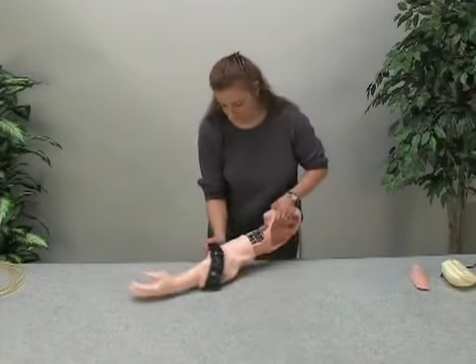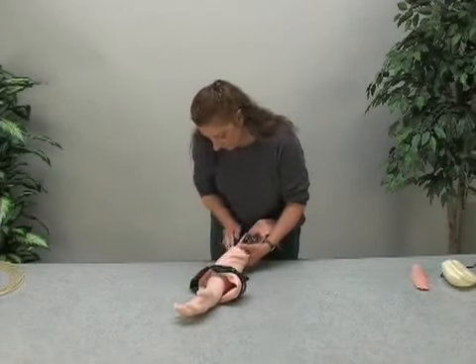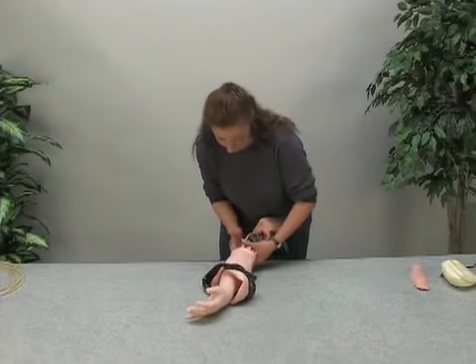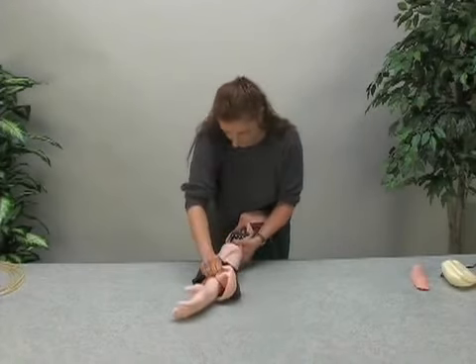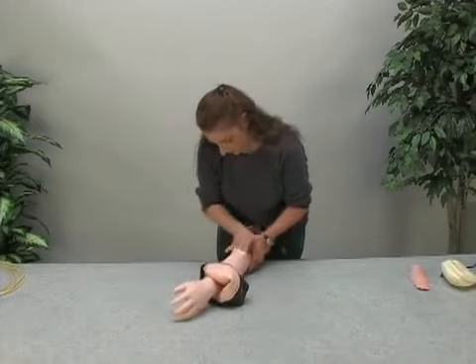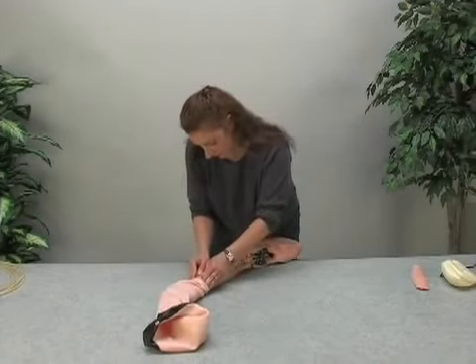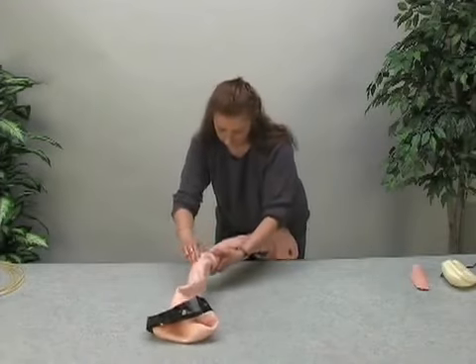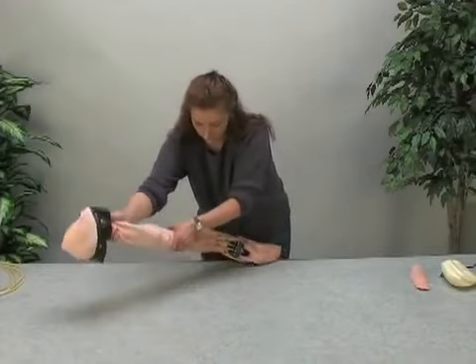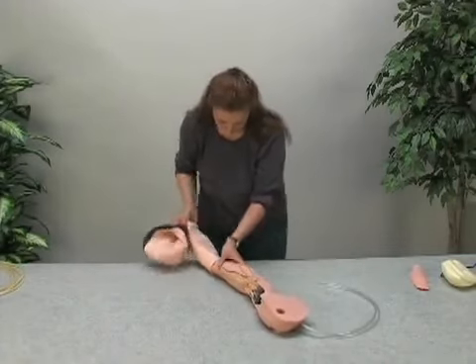The skin may stick to the arm due to repeated injection sessions. This sticking is from the artificial blood drying between the skin and arm. If this occurs, simply work the skin away from the arm. After disassembly, one can clean the arm with normal soap and water if needed. This will not affect future use.